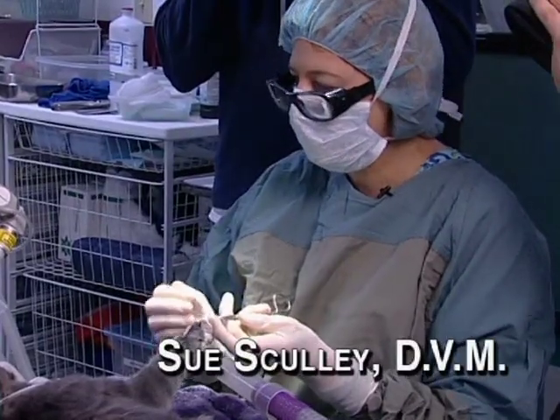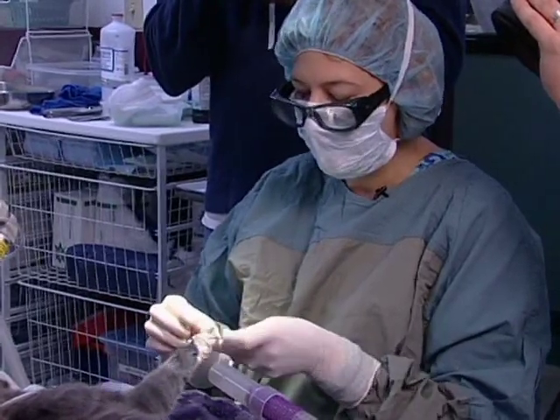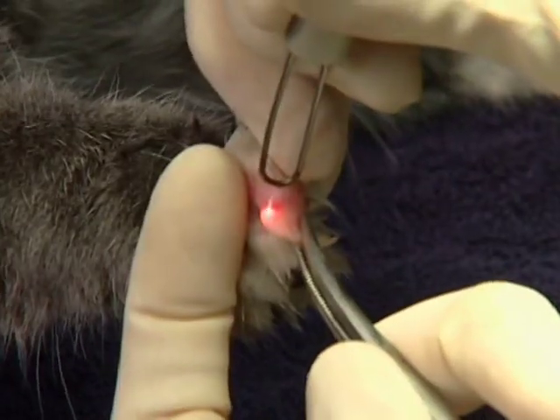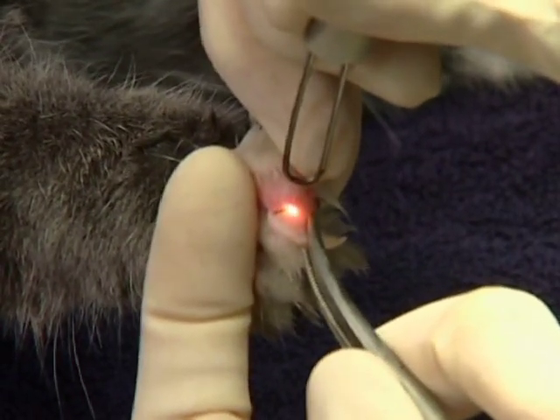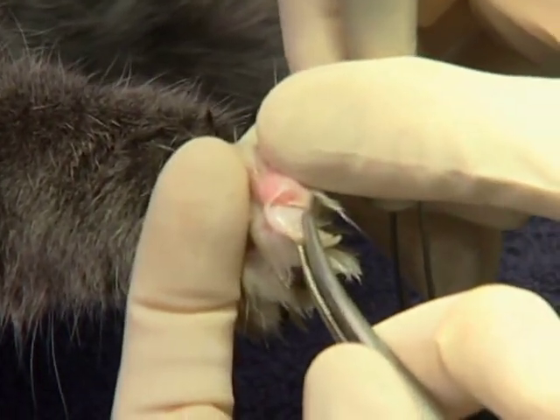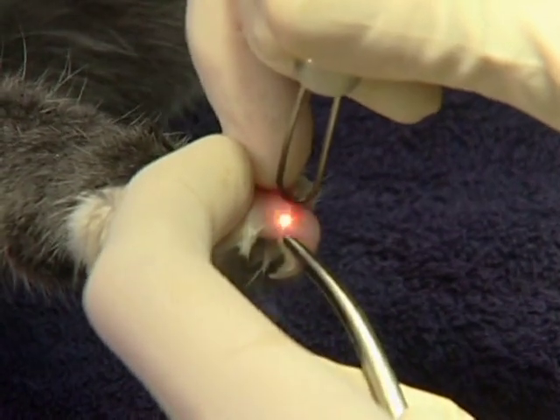The first incision is really just through the skin. It doesn't have to be pretty, and we're not going to hurt any structures. With the laser, you do want to be perpendicular to what you're cutting. Just through the skin. I'm going to turn to get the other side, all the way over, staying perpendicular to the tissue I'm cutting.